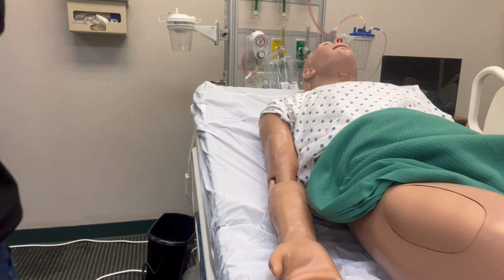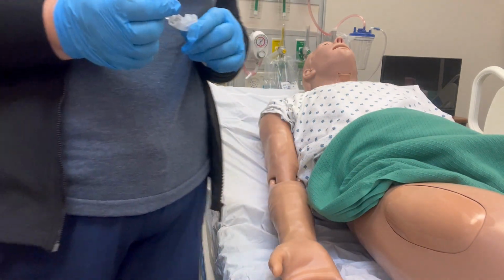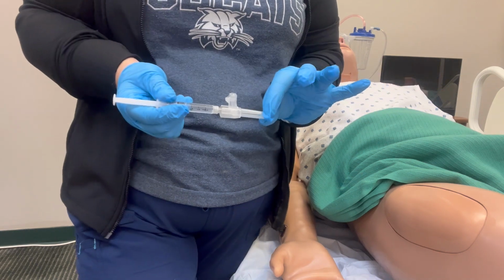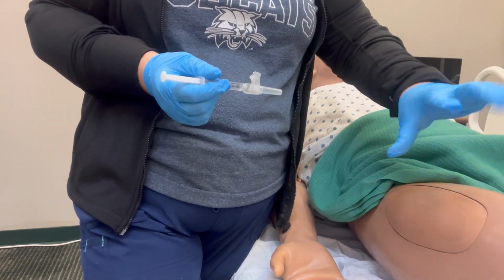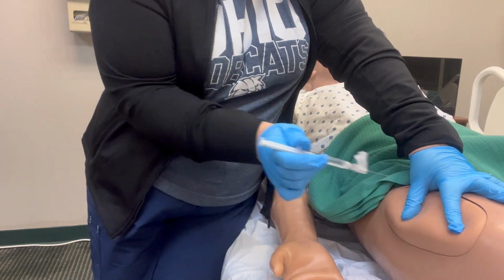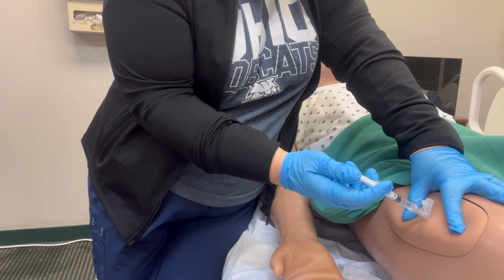So as we know, we're going to clean the site. We want to make sure that for the traditional method, we have the right size needle. And we're going to take the skin between our two fingers here and pull it taut. And once we do that, we're going to take the needle at a 90-degree angle and insert it, and then push the medication in slowly.